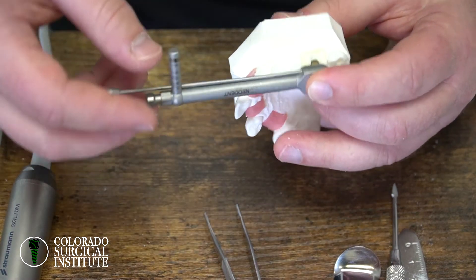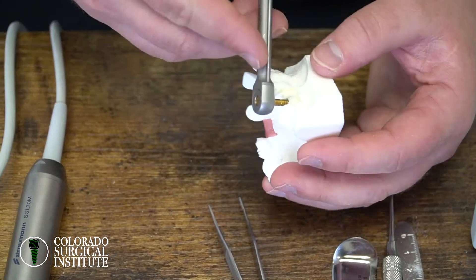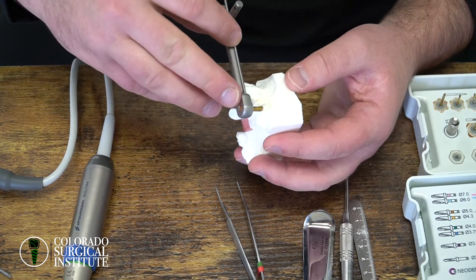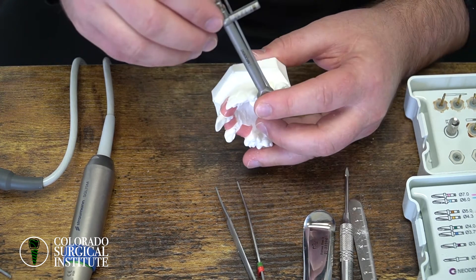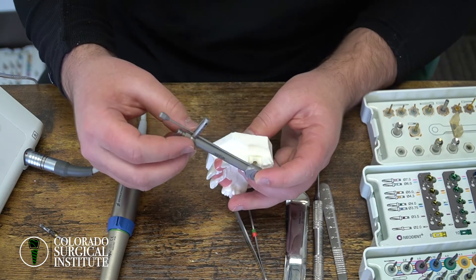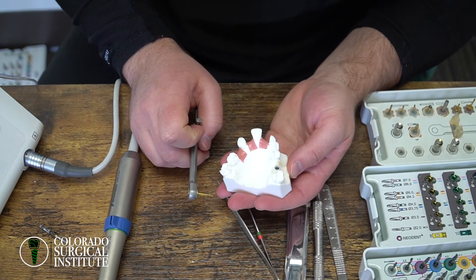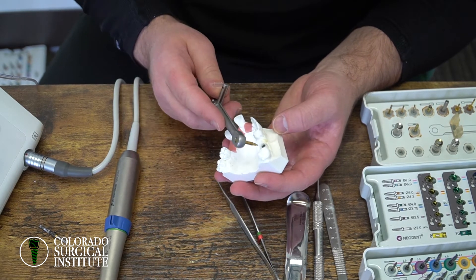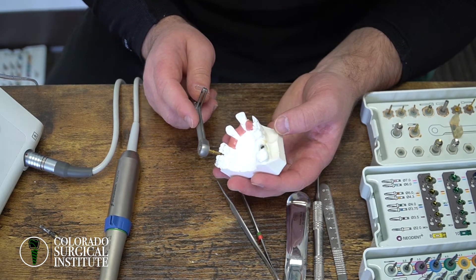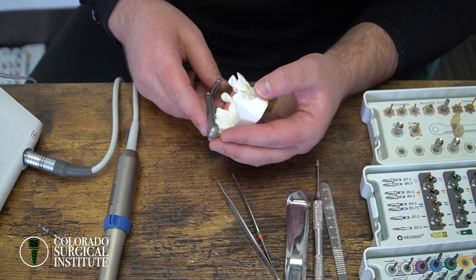You have to get it one millimeter below. If you're even with the cortex and you see that torque is already at max, your options are: unwind it — go reverse one, two, then go forward one, two, three — and do that several times. You may have to repeat it four, five, or six times to get even a millimeter deeper when it's too stable. If you still can't get it, don't accept being even with the cortex. Take the implant out and drill a little bit wider one more time, then put the implant in. You want a very long-lasting implant.